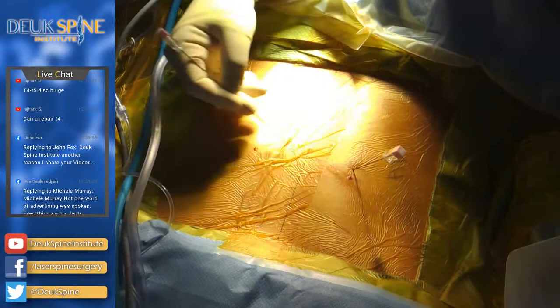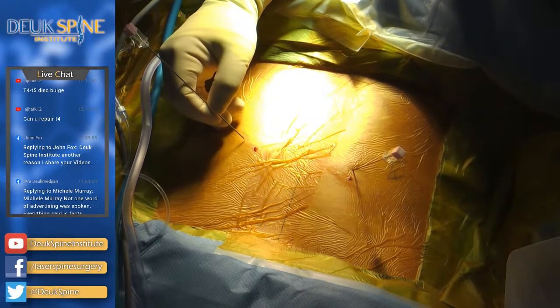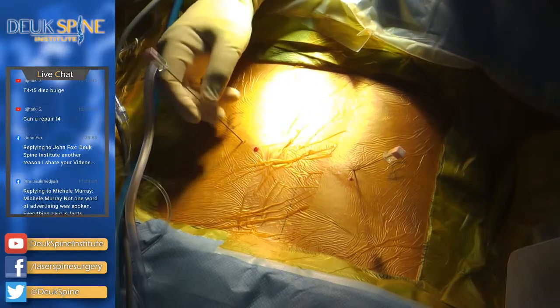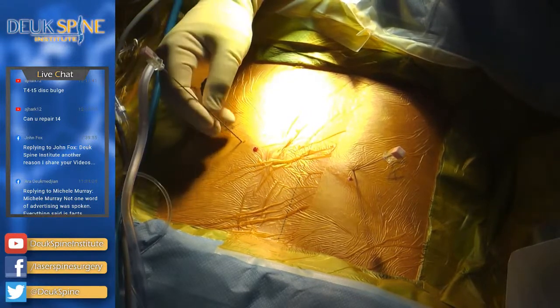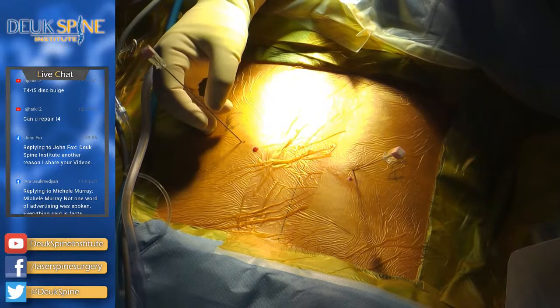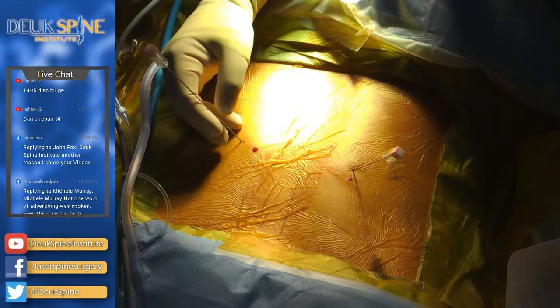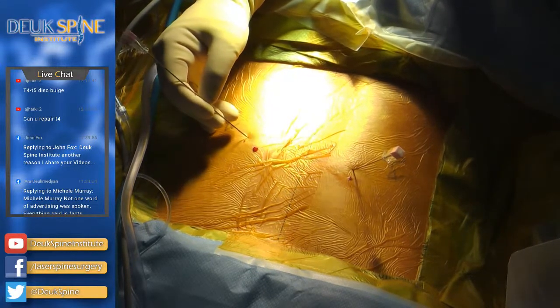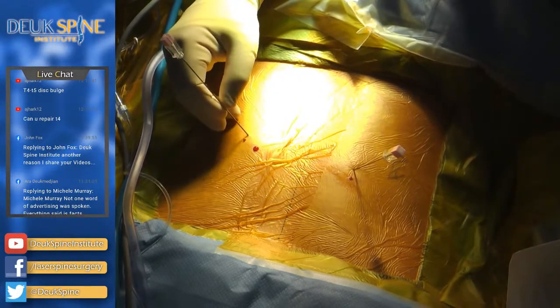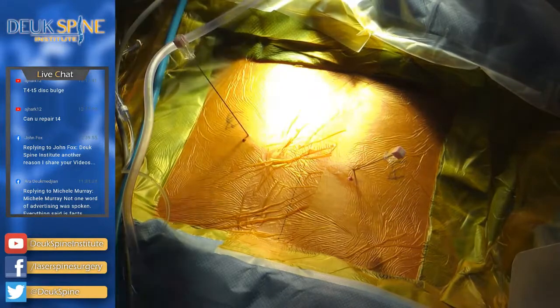So I wanna envision you, and to be a surgeon, you really have to have good three-dimensional visualization. That's one of the requirements to be a good surgeon, is to be able to visualize things three-dimensionally. And so that's what I'm doing right now. I think I'm a little higher than I should be. I may want to come down a little bit. You're doing great, just relax. Are you comfortable? Shot. All right, so I'm gonna try to follow a similar trajectory.